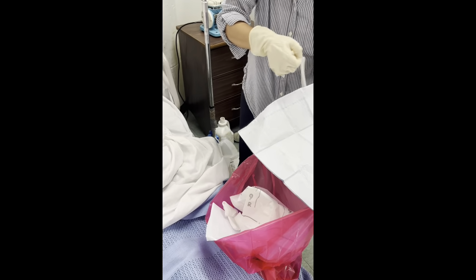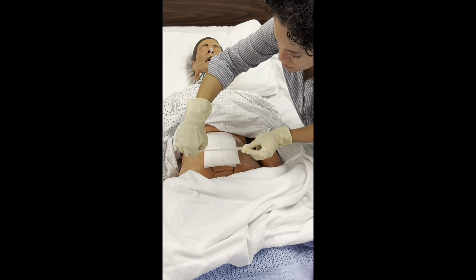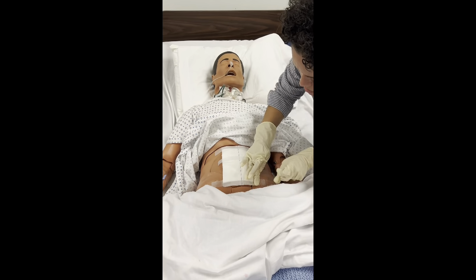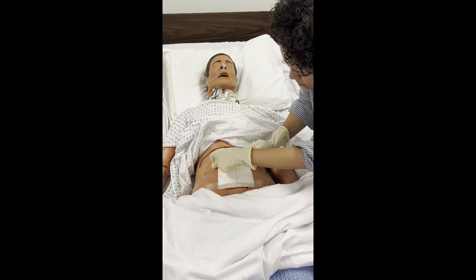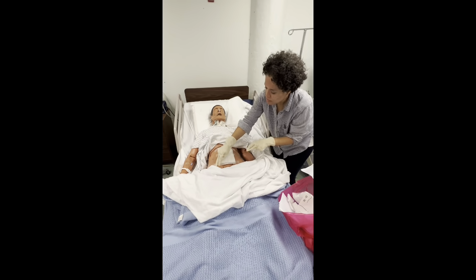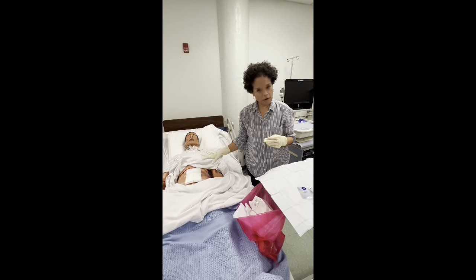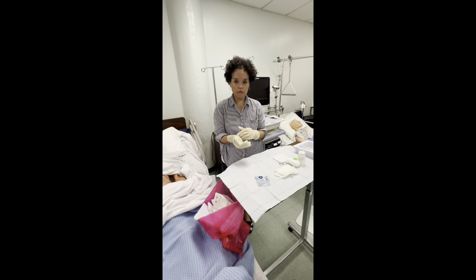Last one. On the bottom. Okay, so now the site is covered and there's a fresh pad on top. So now we're going to remove the gloves.